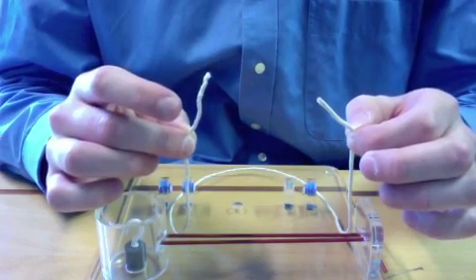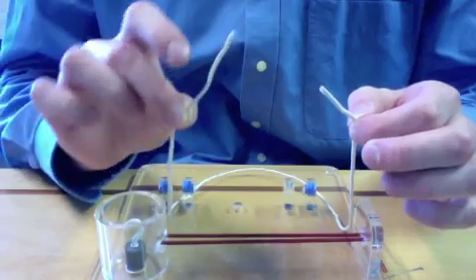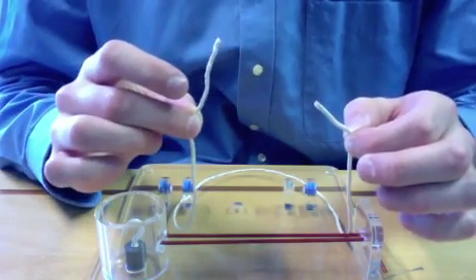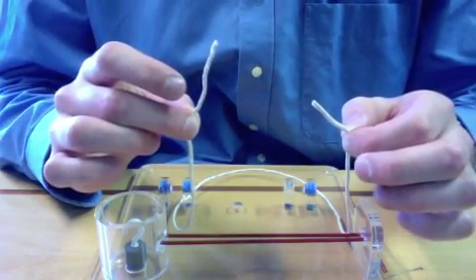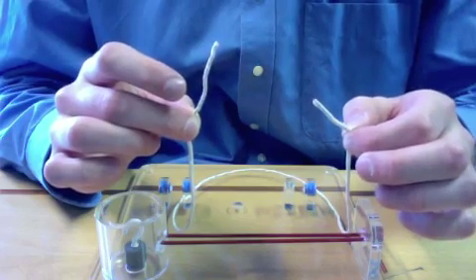I have taken the right side of the string between my middle finger and my thumb. I wrap the left side of the string around the tissue I want to tie off and take it between my thumb and index finger.